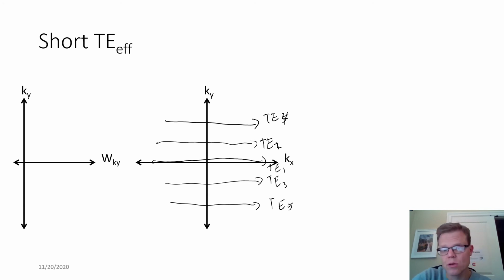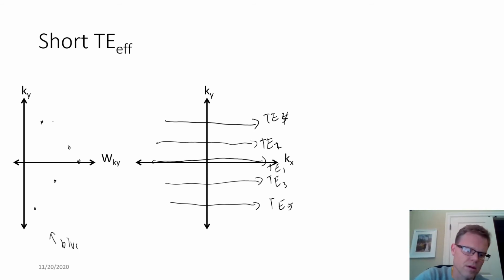And so we go back to the pulse sequence diagram and just redesign those phase encoding gradients for the given spin echoes, such that we go to the center of k-space first, and then we get this weighting function where we have the highest amplitude weighting at the center, and then this decay is happening as we go away from the center of k-space, and this will also lead to, again, some sort of blurring.